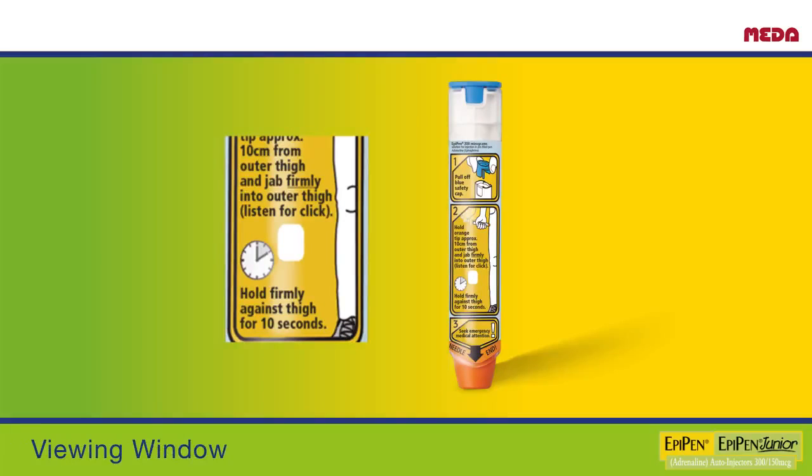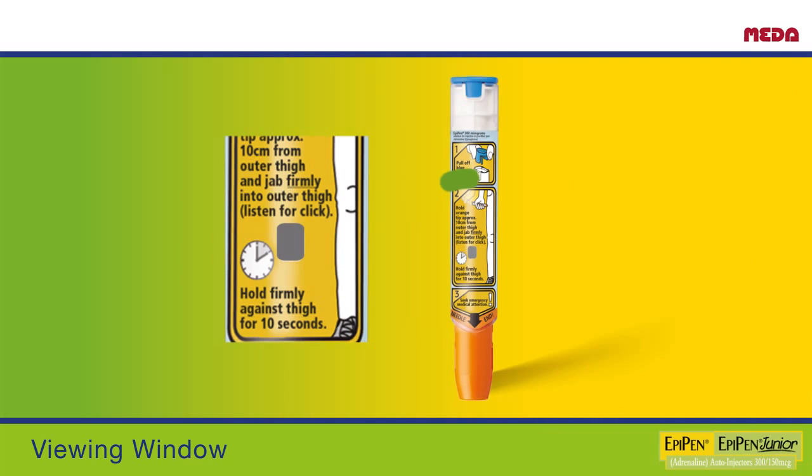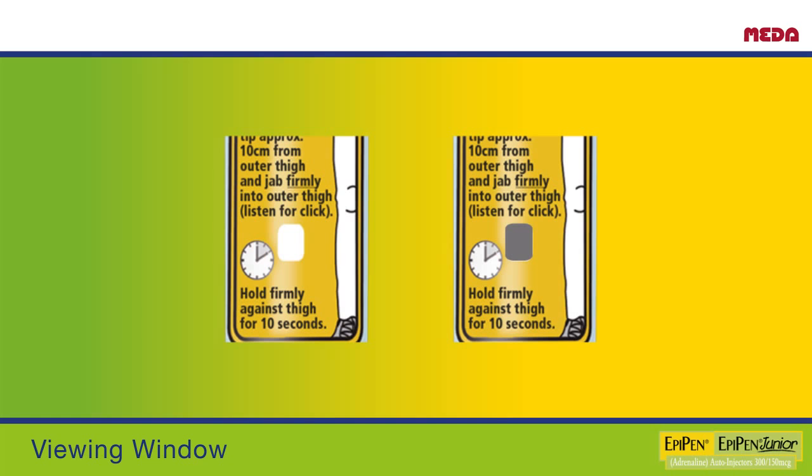The viewing window lets you check that the solution is clear and colourless. It is important to check this regularly, as you will need to replace your EpiPen as soon as possible if the solution becomes dark or cloudy. The viewing window also allows you to check that you have used your EpiPen correctly — when the dose of adrenaline has been injected, the window becomes darker. There is a noticeable difference before use and after use.